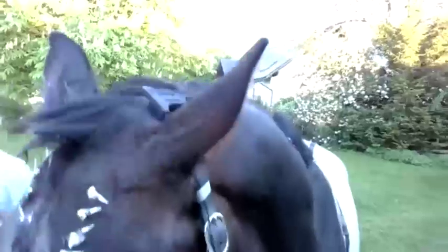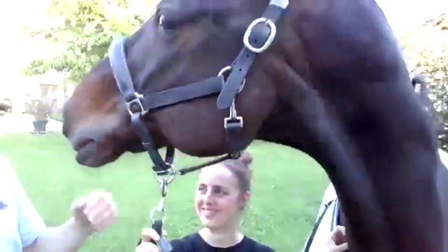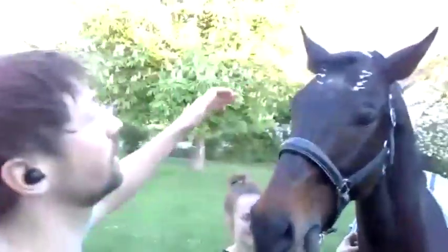You can also see how easy this is. I just take it off, these magnets are attached, and then I show it first to Dreamy, and then attach the next one. It's blinking in blue, if you could see it on the video, maybe not.